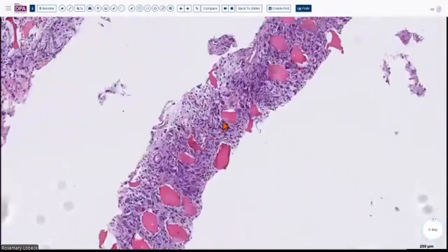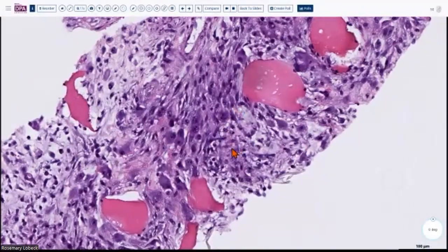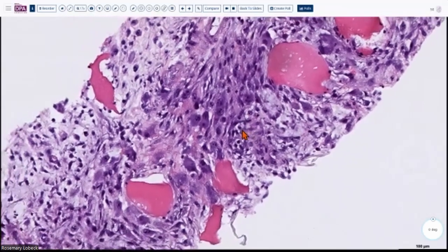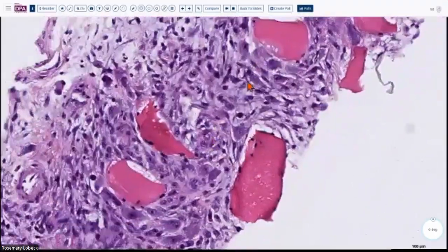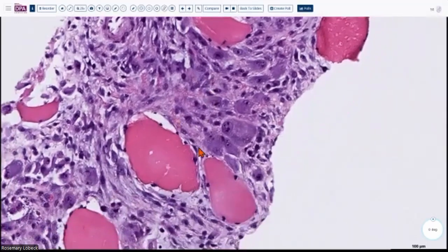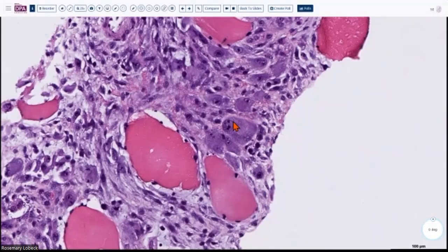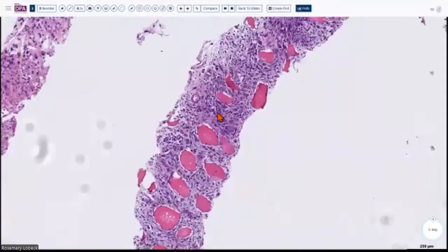So we take a closer look at what's happening in the infiltrative lesion, and we immediately notice that, yeah, they were absolutely right in calling this undifferentiated pleomorphic sarcoma, because it looks so ugly, there is so much pleomorphism, and if you look, you could see mitotic figures that some might argue are even atypical looking. Then you see these huge cells that have an eccentric nucleus and abundant purple cytoplasm, almost like a ganglion cell-like appearance, right? But there's something that is weird about this case.